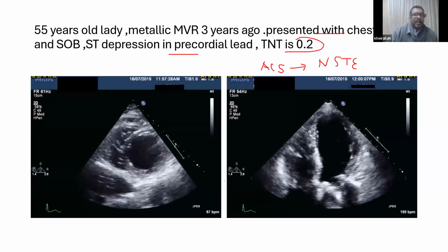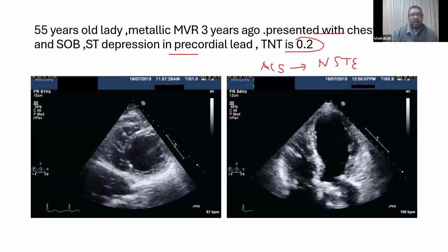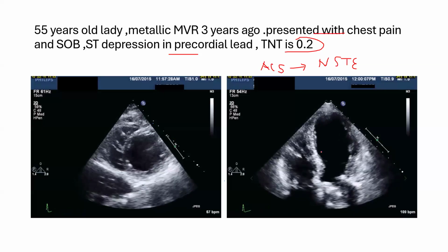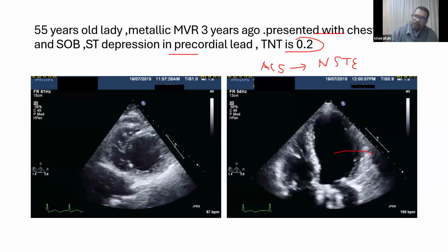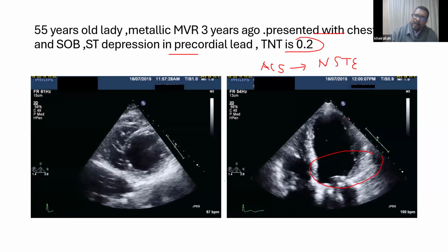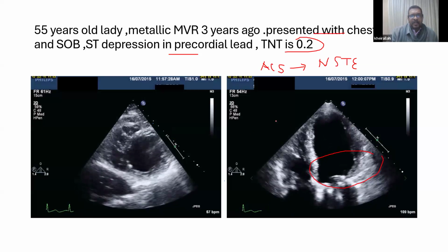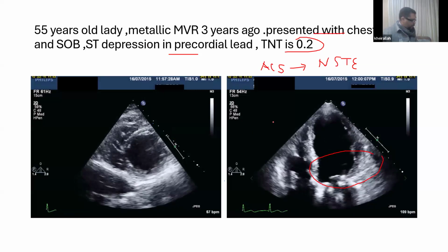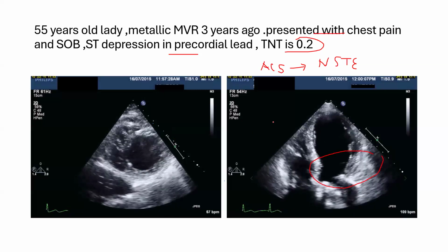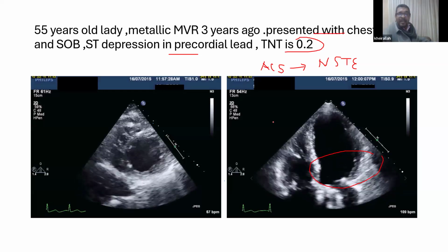We have done an echo for this lady, and this is the echo. What's the problem here? Apical dilatation. Exactly. If you look, the base of the heart is contracting, but from the mid to the apex it is not. And here the apex is severely hypokinetic. So what's your response here? What's the best course of action you suggest? Do the coronary angio. Exactly. We have done an angiogram for this lady and it's normal.